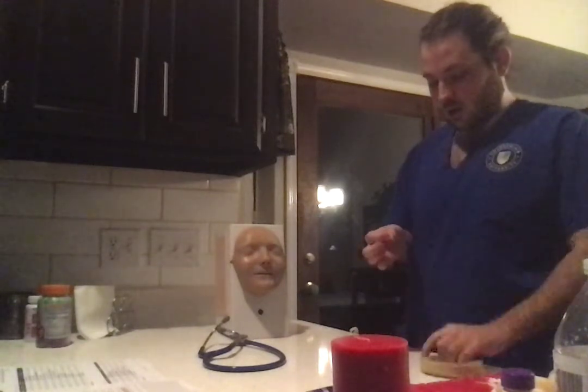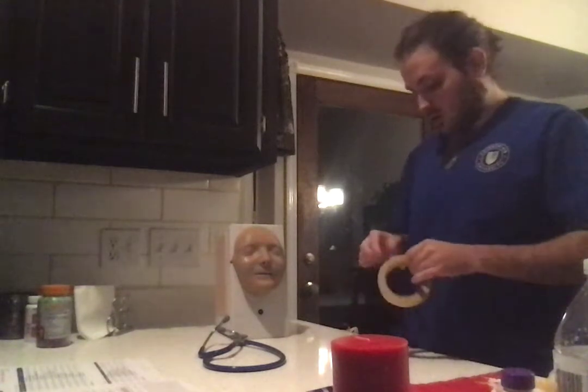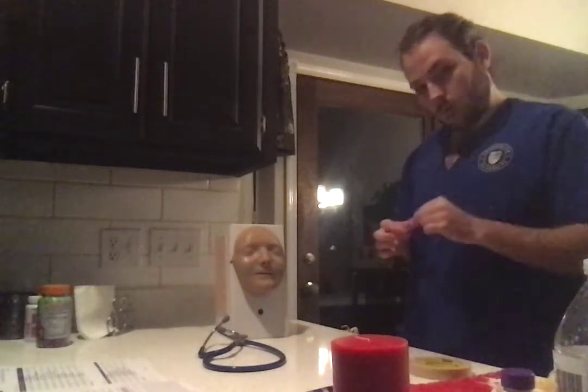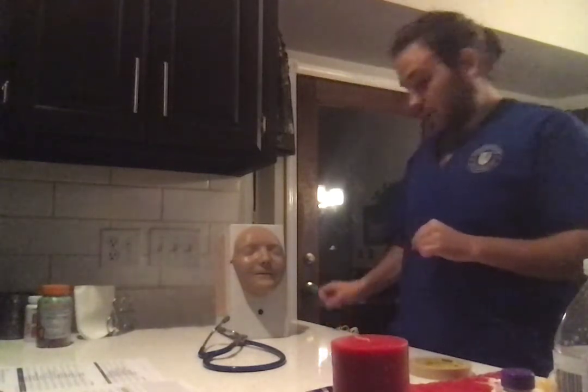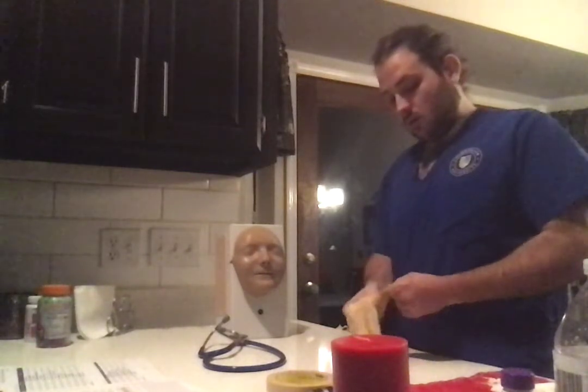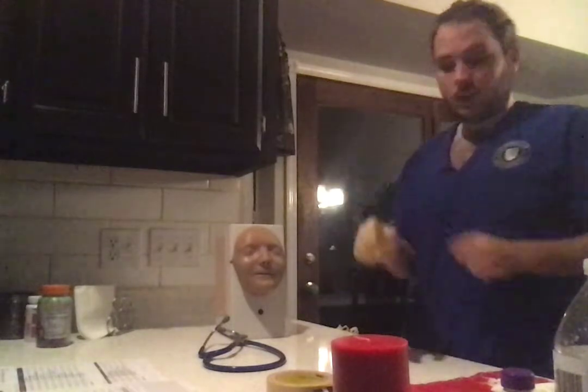Another to anchor onto the gown. And a third to measure how far I need to be placing this NG tube once I've measured it. So now I will be doing the assessment before conducting the placement and removal. We would don our clean gloves.